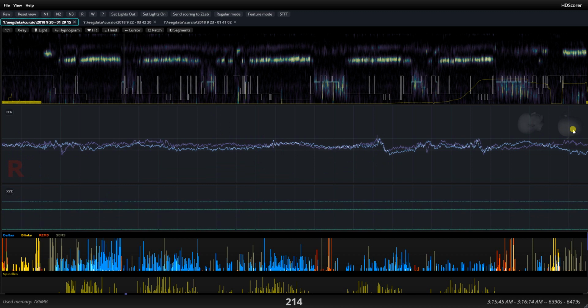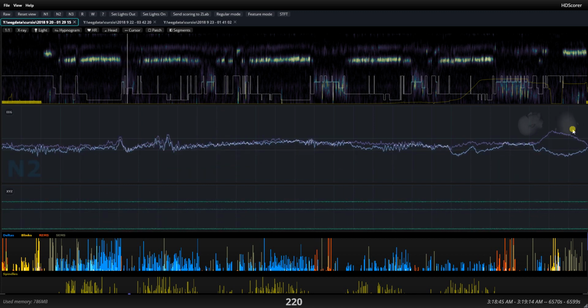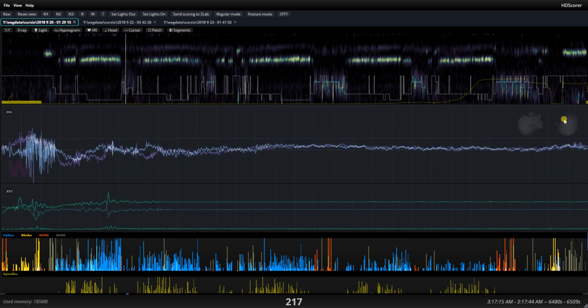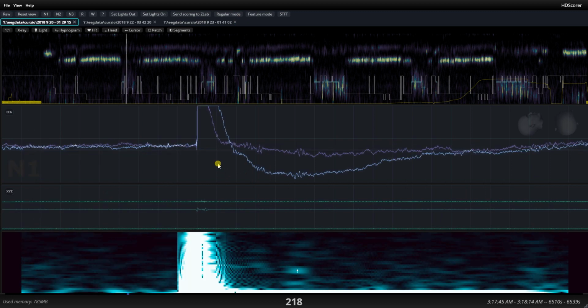Okay, so here they're sleeping with their head on the right side, and here they move, well, I move with my head towards the top. So that, and plus I do have a little bit of alpha waves, but I can't count on that algorithmically for every single person, because simply some people are not frontal alpha producers, and so I wouldn't catch that. But this definitely is an awakening for me.